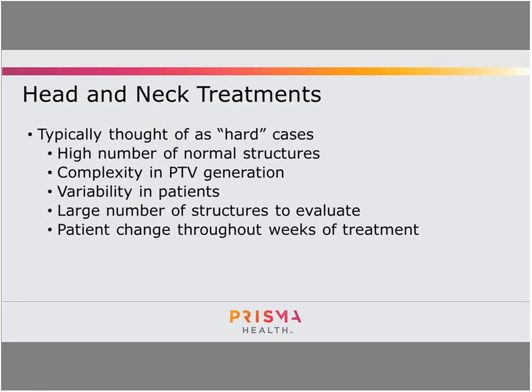I'm giving this talk hoping that people have a pretty good concept of head and neck planning, or just treatment planning in general, and what an optimizer does. Head and neck treatments are normally thought of as harder cases, for a variety of reasons. You have a high number of normal structures, so just lots of things to contour and keep up with. There's a complexity in PTV generation that you're not going to see in a prostate patient.